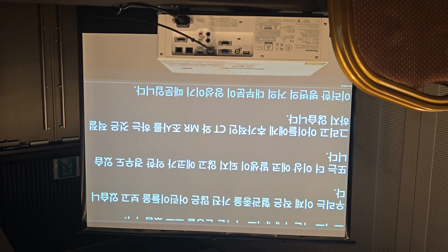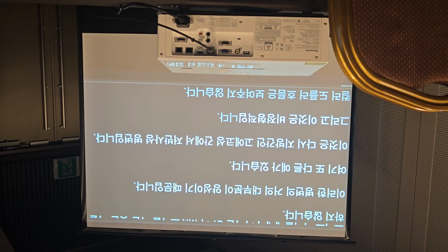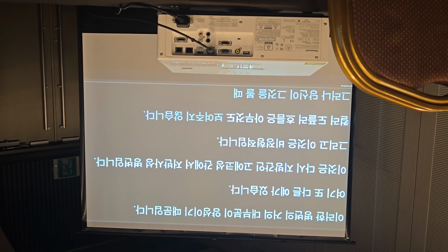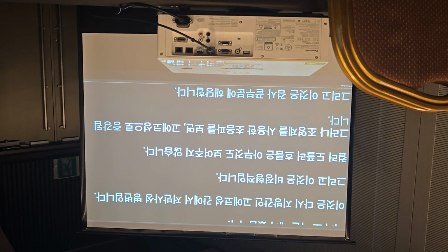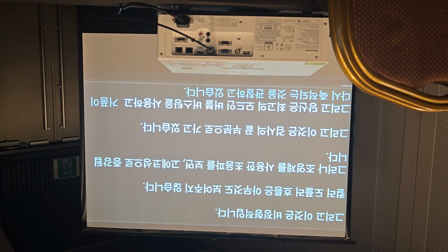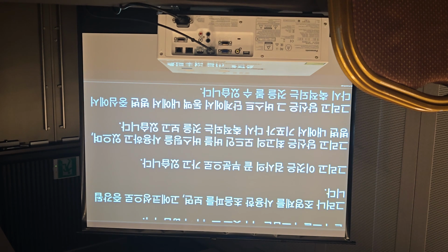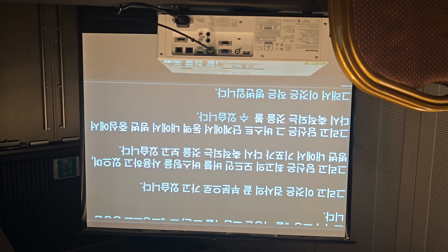This is again a low reflective lesion in again a high echogenic liver, which is a fatty liver, and it's atypical. The color Doppler flow doesn't show you anything, but when you look at the contrast enhanced ultrasound, it's hyper enhancing. This is towards the end of the examination, and you're using the burst mode, bubble bursting, and you're watching reaccumulation of the bubbles within those lesions, and you can see on that burst phase the reaccumulation in an arterial phase from the center of that lesion. So this is a small lesion within this liver, but it's characteristically a focal area of focal nodular hyperplasia.